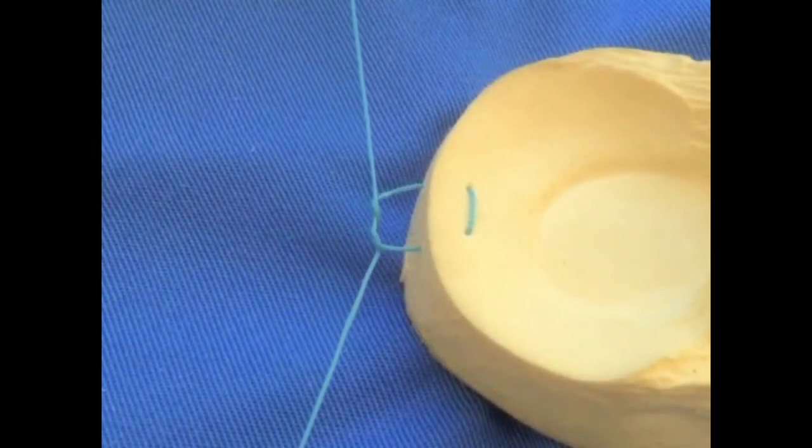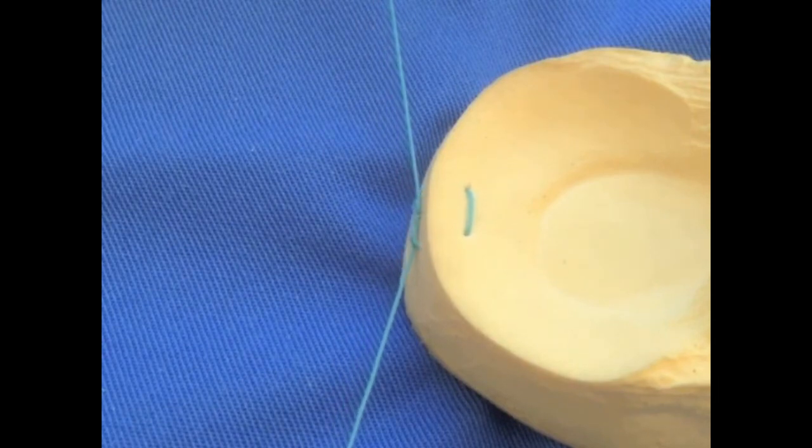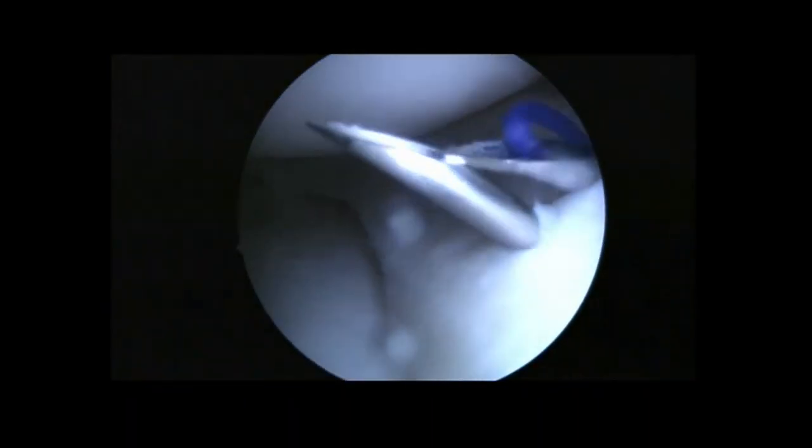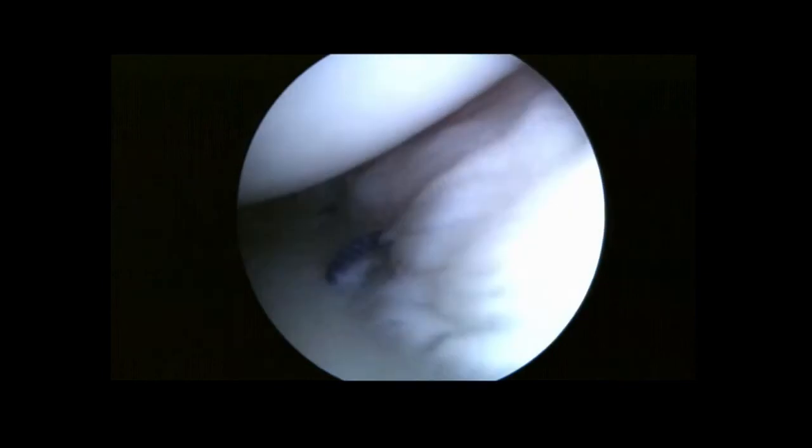Retrieving both suture ends through a skin incision will allow tightening the knot over the capsule. Arthroscopic visualization is recommended during this step. This procedure is repeated for the other desired meniscal site repairs. This middle segment meniscus has been reattached to the deep and superficial capsular fibers in order to restore meniscal stability.